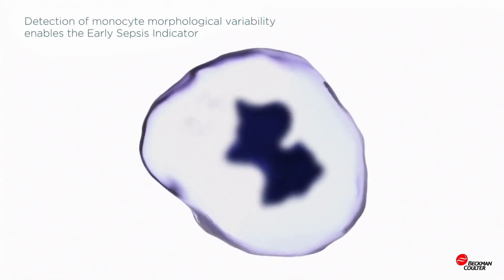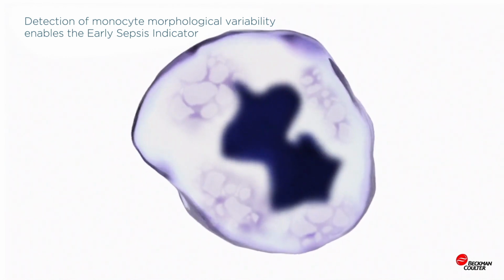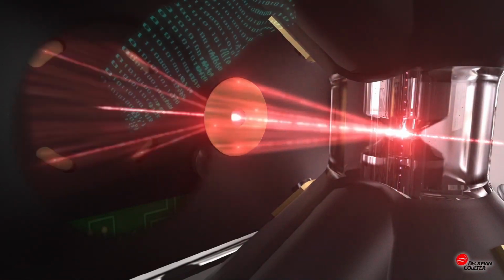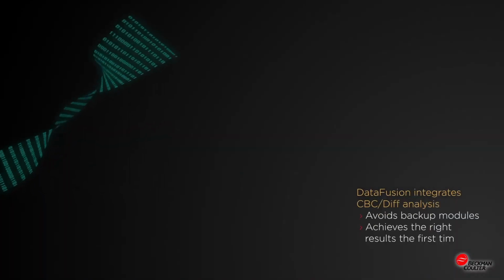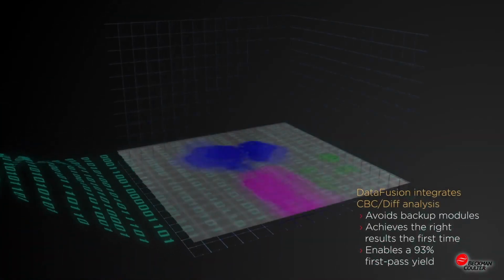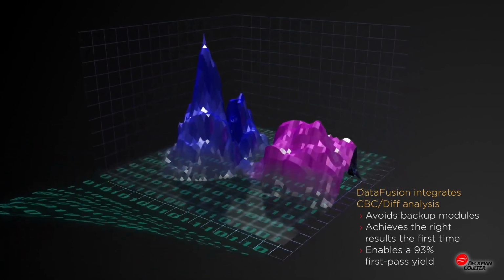Using hydrodynamic focusing, the cells are sent through an aperture one cell at a time. During this, a laser is directed at them, and the scattered light is measured at multiple angles. The absorbance is also recorded. The cell can be identified based on the intensity of the scattered light and the level of absorbance. A 5-part cell counter can differentiate all WBC types: neutrophils, lymphocytes, basophils, eosinophils, and monocytes.